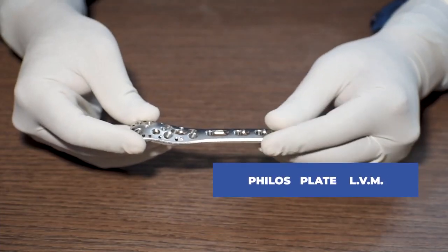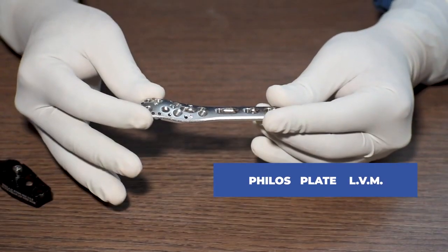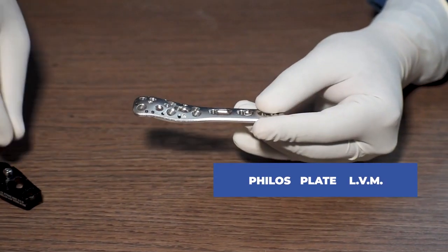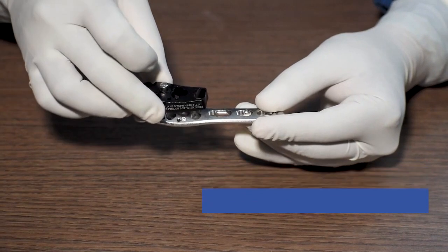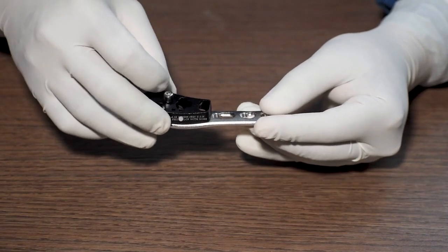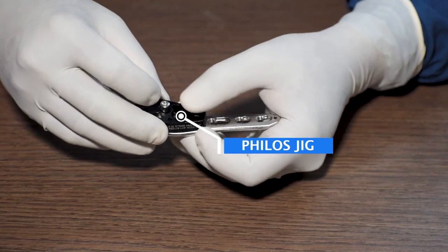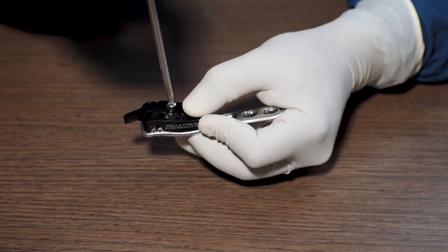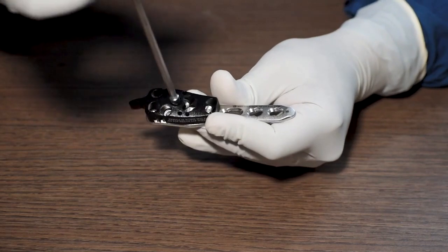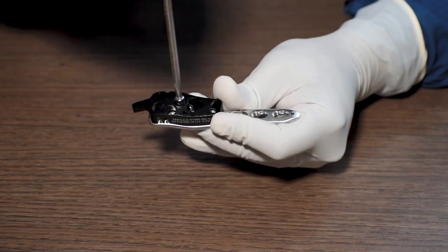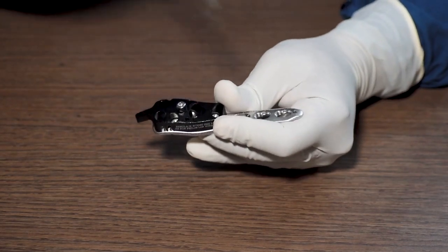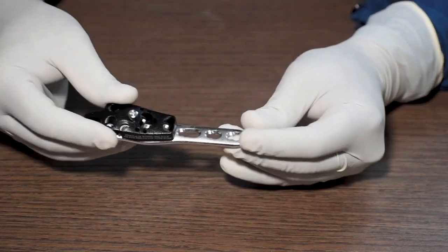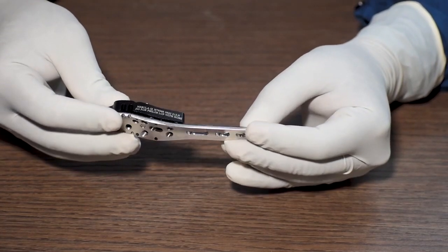This is the PHILOS plate LVM product. To start with, we will take the PHILOS plate and then attach the PHILOS jig with it. We will take a screwdriver and tighten this middle nut. Now the jig is completely attached with the PHILOS plate.